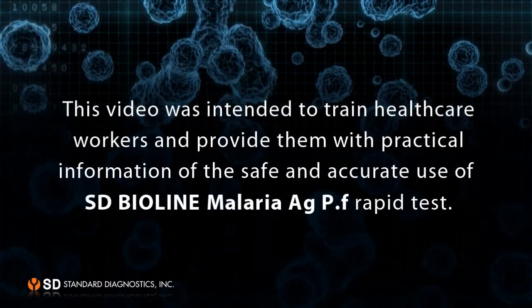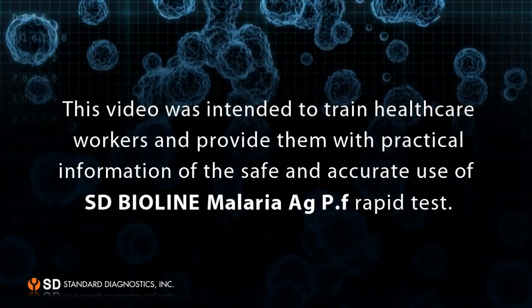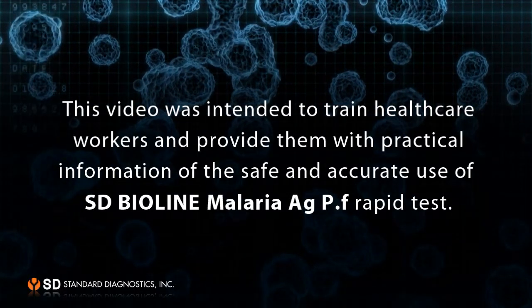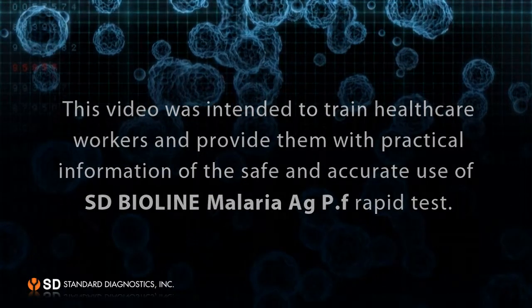This video was intended to train healthcare workers and provide them with practical information on the safe and accurate use of the BIOLINE Malaria Antigen PF rapid test.